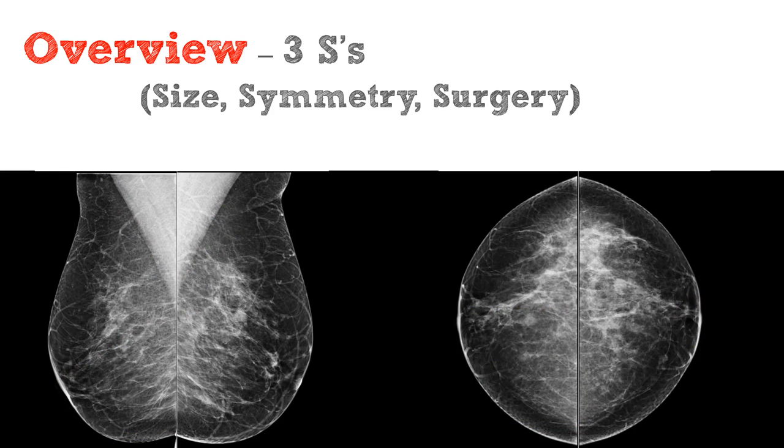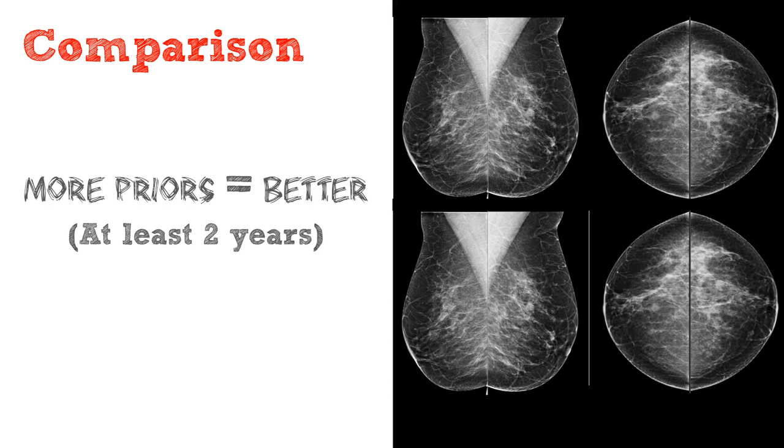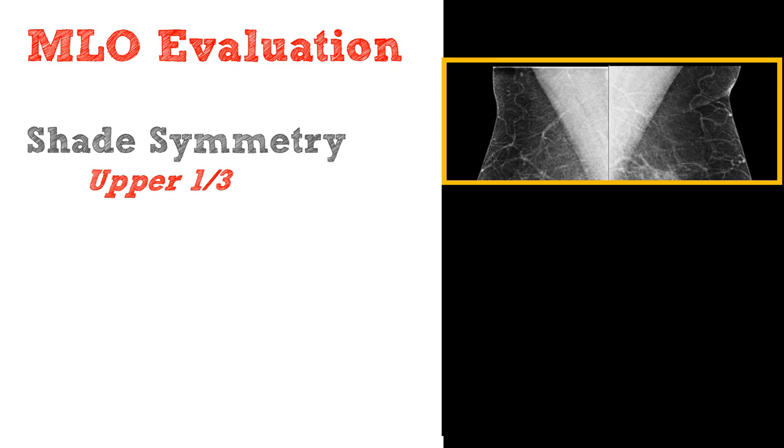Next, once you've ensured that the mammogram is technically okay, you want to take a quick general overview of the image. We like to use the 3 S's, looking at size, symmetry, and surgery. Compare the breast side to side. From here, you're going to compare with prior studies. The more prior exams you can obtain, the better. You want to ensure that you can at least go back 2 years. If you see a small mass or asymmetry that's been on the images for several years, you're done. No further workup is required.